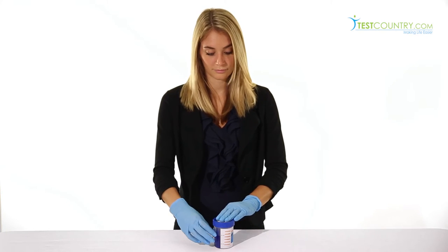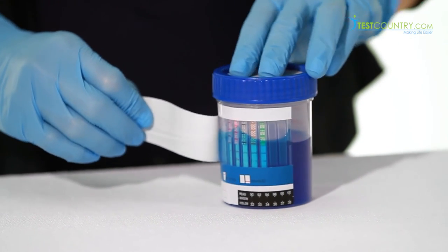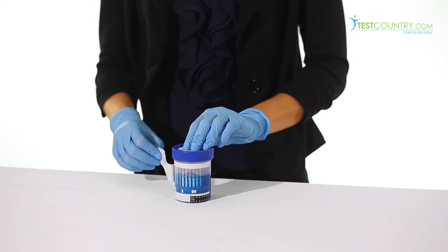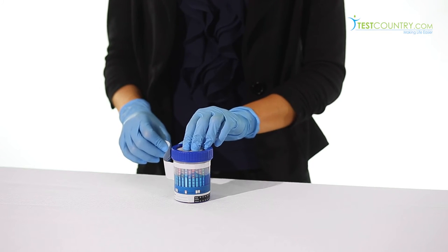After waiting five minutes, the collection official will peel off the cup label to interpret results. Results must be read between five and ten minutes after collection. Do not read after 10 minutes — the results are invalid.